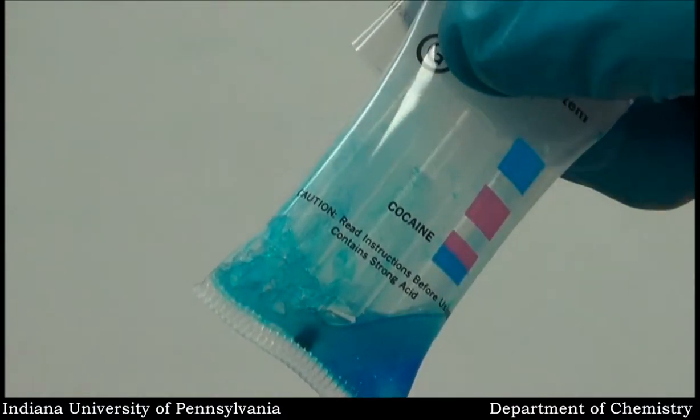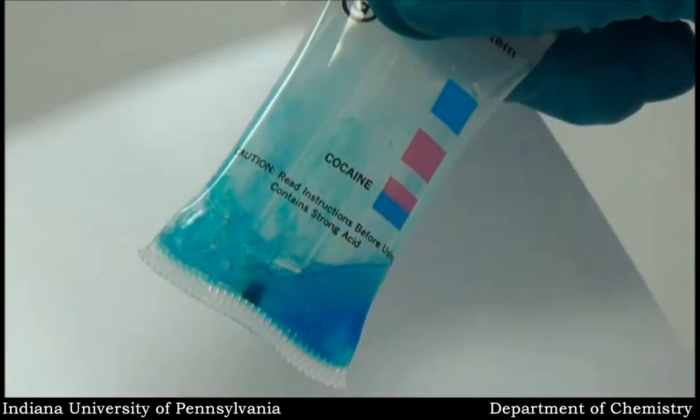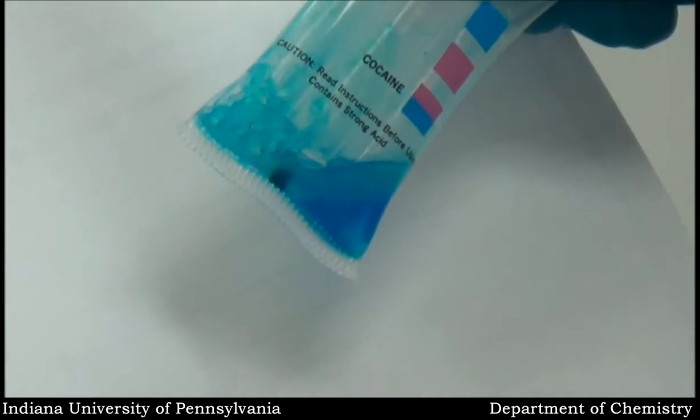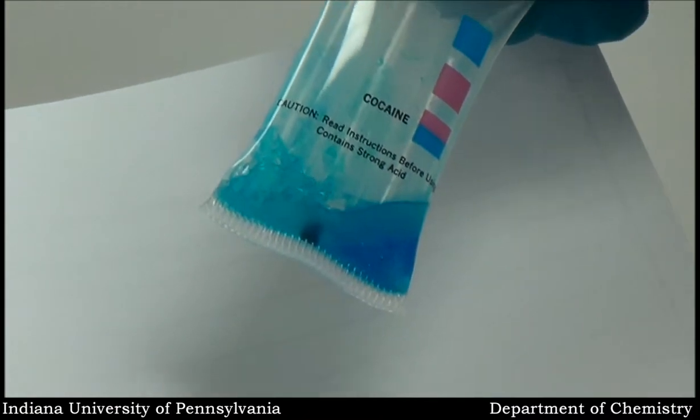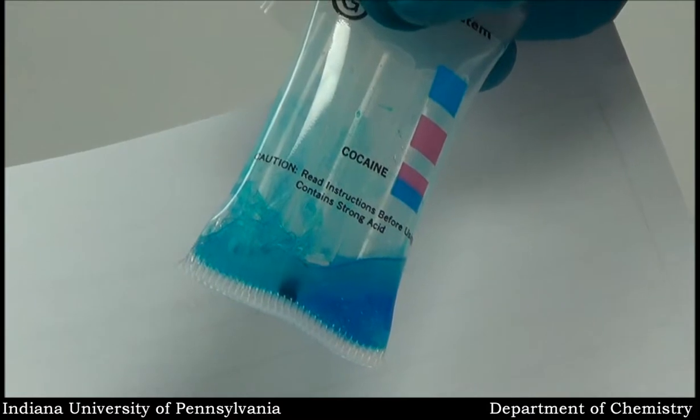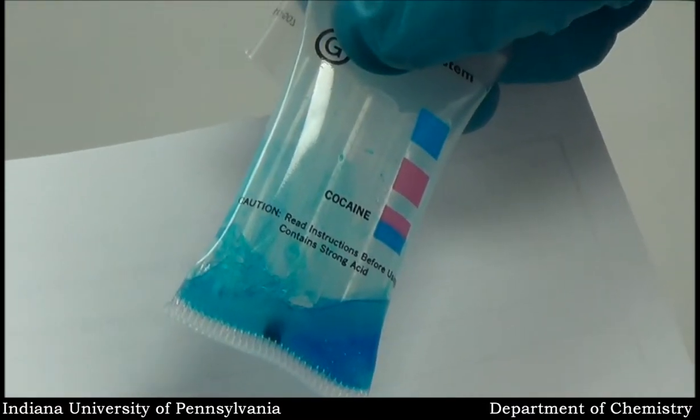I'll put some paper behind it. Once I put the white background you'll see the pink. So that would be indicative of a positive response — a positive presumptive test for cocaine — the fact that we have the pink and blue separation of colors in the container.